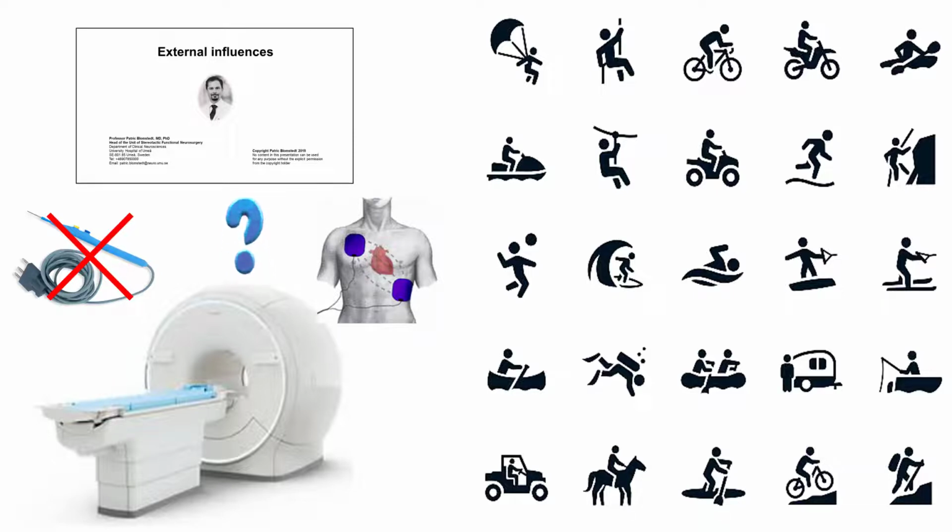However, the implants can be affected by external forces, which we need to take into account when performing cardioversion, diathermia, MRI and such. With modern implants, MRI can be done, but it is important to know which implants the patient has and to follow the specific protocols. When questions arise, it is best to contact the responsible DBS center.